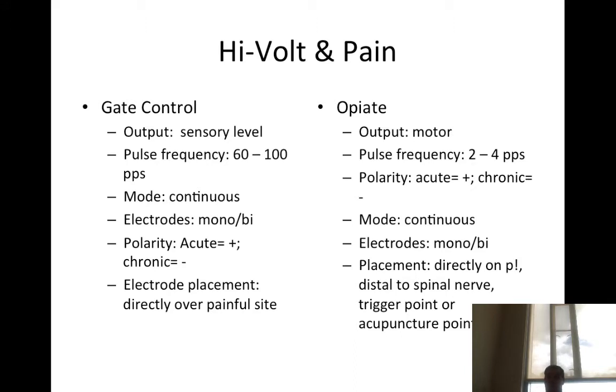Distal to spinal nerve, trigger point or acupuncture point. So say I have that trigger point back here. I could place that one pad right on my trigger point and a dispersive pad somewhere else if I'm trying to stimulate the opiate release.